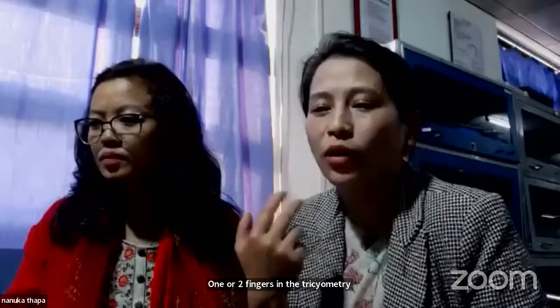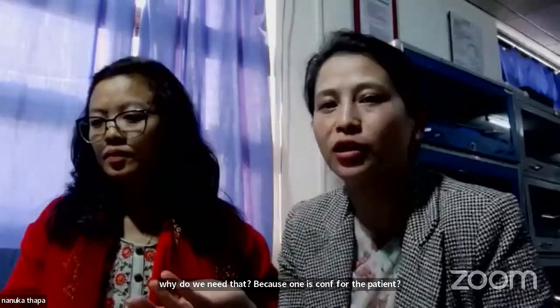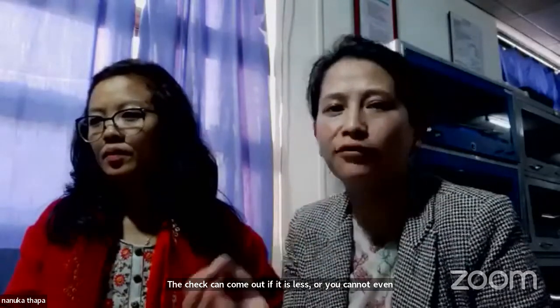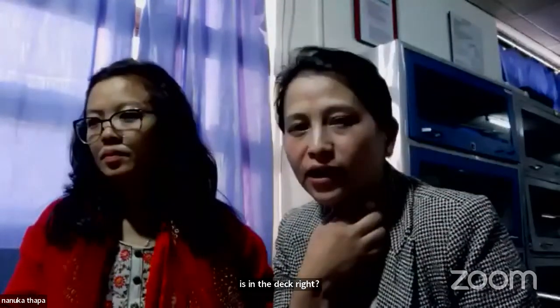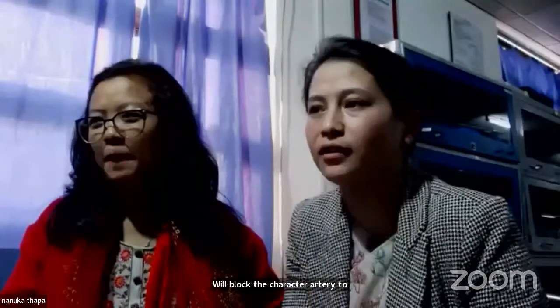Because one is comfort for the patient, okay? And if you have more than two fingers, it means the tracheostomy tie is too loose, so it might get dislodged and the tracheostomy tube can come out. If you cannot even insert one finger, it means it's too tight. So it can cause skin irritation and discomfort to the patient. Also, the main artery which supplies the brain is in the neck, on the side of the trachea. If it is too tight, it can block the carotid artery from supplying blood to the brain, okay?